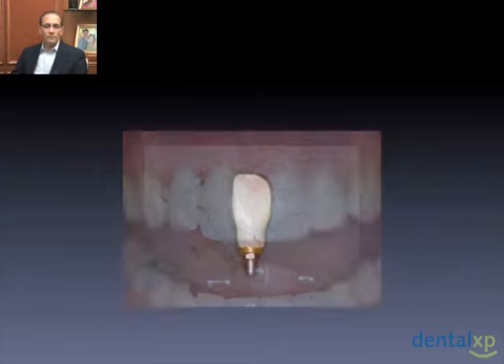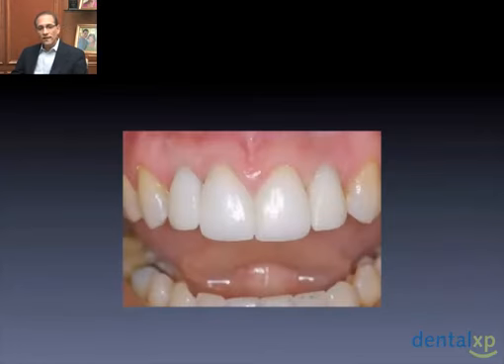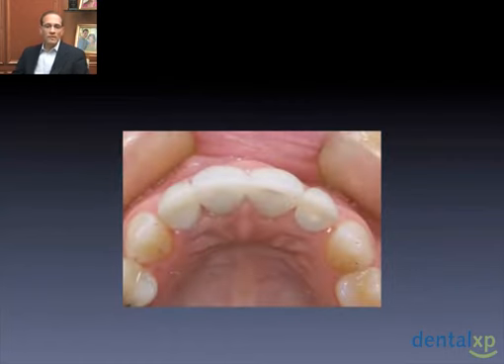And once we bring it to place, now we can see that that provisional does provide good support for the soft tissue, helps to guide the soft tissue in its final growth and healing position, as well as support the interproximal papilla. From above, the occlusal dimension, and then onto creating the final abutments and the final crowns.